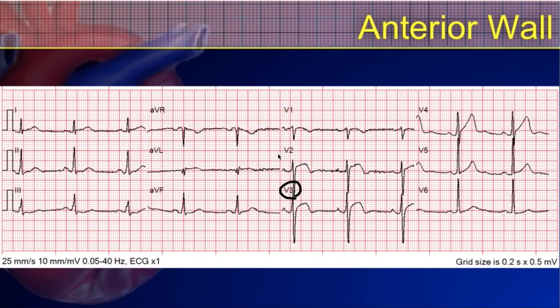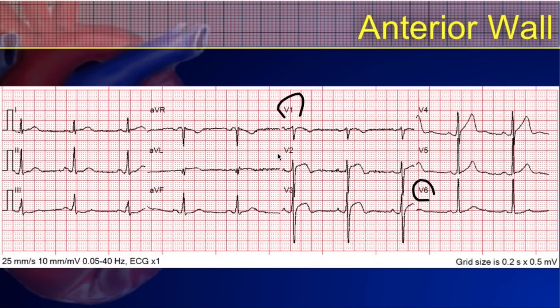Here's an anterior wall infarct. The anterior wall corresponds to V3 and V4, and that's where the changes are seen. There are no true reciprocal leads for the anterior wall, so no reciprocal changes appear on this 12-lead. However, there are changes extending into V2, and it's worth noting that any sequential precordial leads — V1 through V6 — are also contiguous to each other. V2 and V3 being contiguous means this would be classified as an anterior-septal infarct.